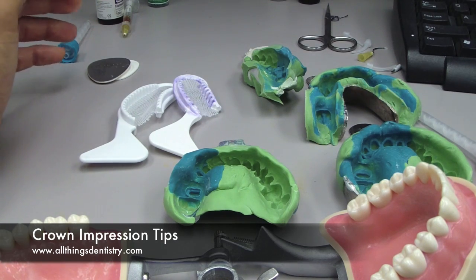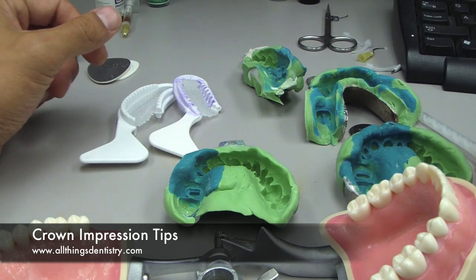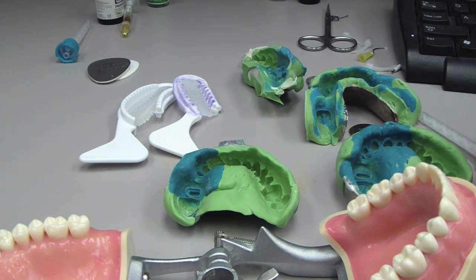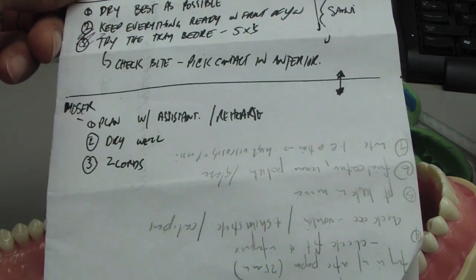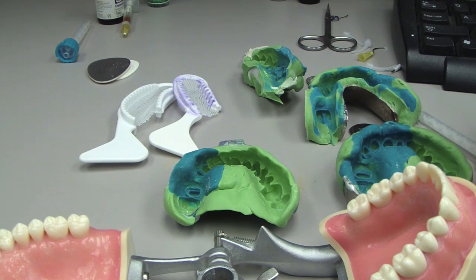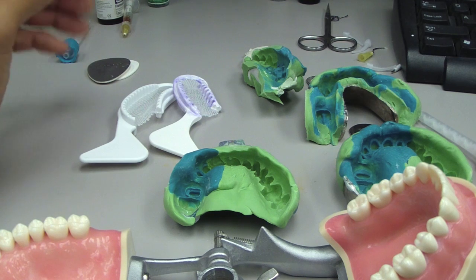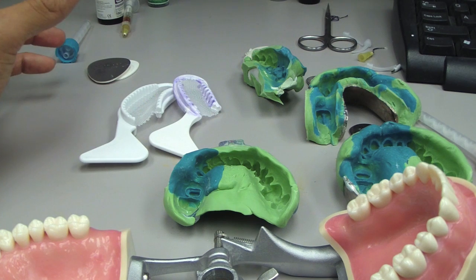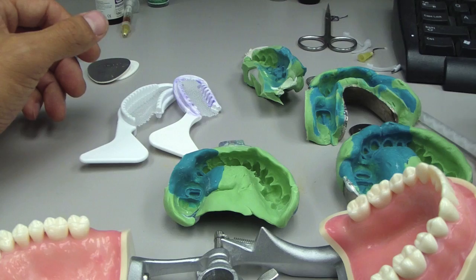Hey folks, Ashley here, allthingsdentistry.com. I had a request by a viewer to see if I had any impression fabrication tips, making a final impression tips. I went around the residency and talked to a bunch of folks. I have about eight to ten little tips and hints that have come out that I didn't know before that we've talked about in the residency, and this is a great way for myself to remember as well.